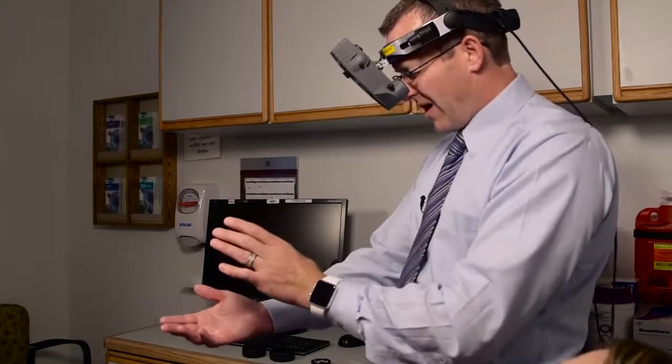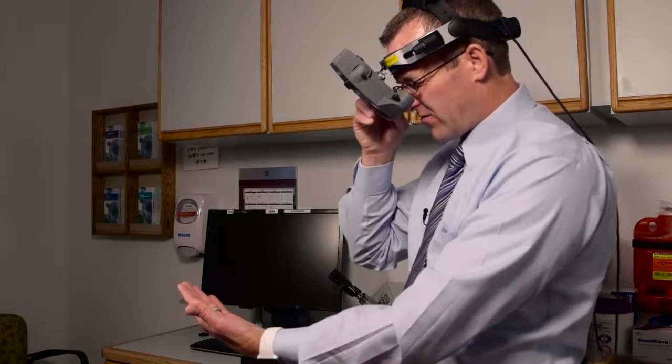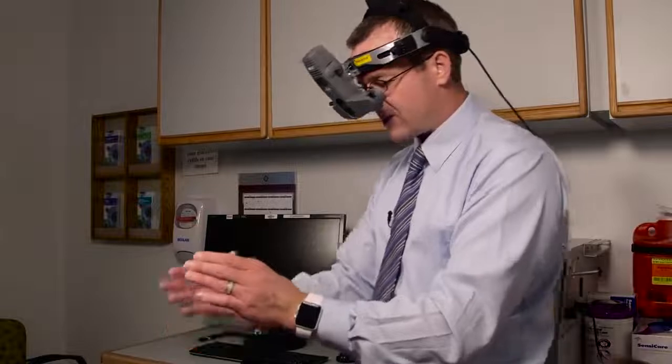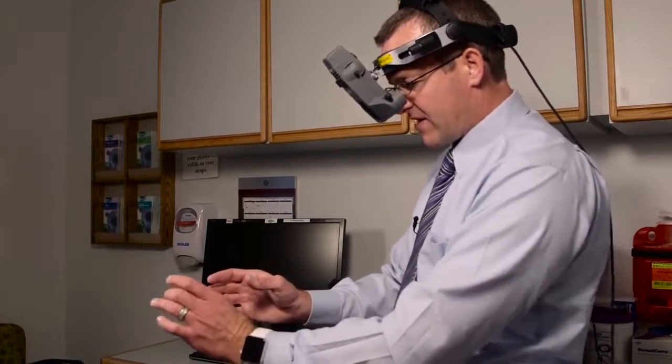Also, I open and close each of my eyes to make sure that the beam itself is located in the center for each eye. And it's actually going to be the center a little bit left for the right eye and the center a little bit right for the left eye. But this is a critical concept, depending on the distance between your own two pupils. You want to make sure in each eye that you can see the entire beam.